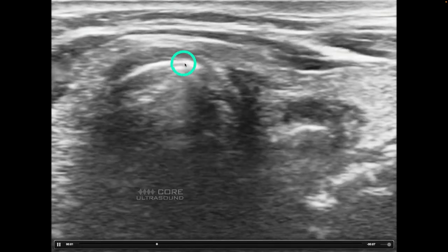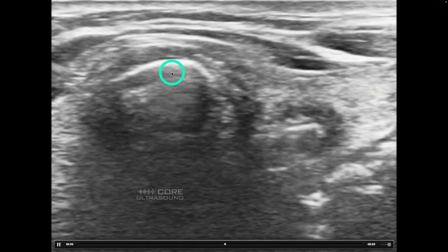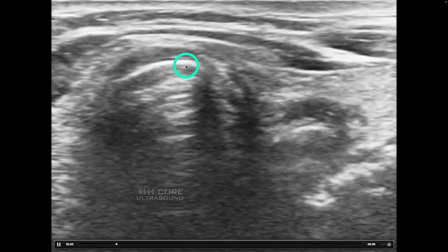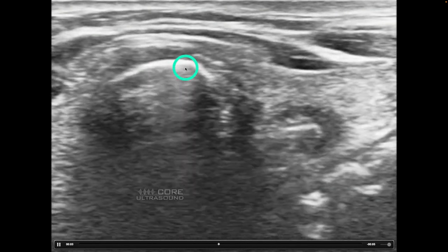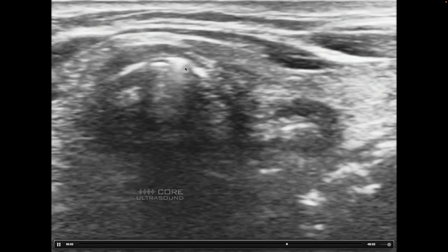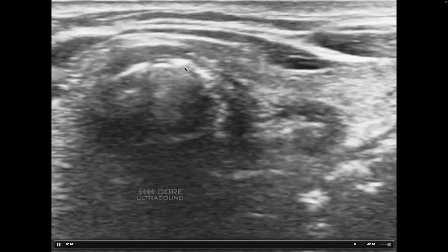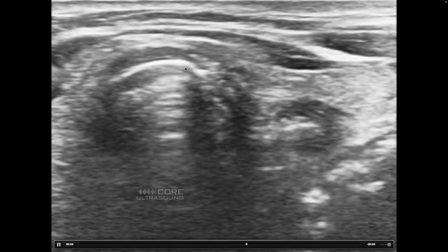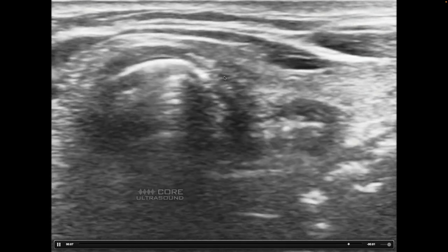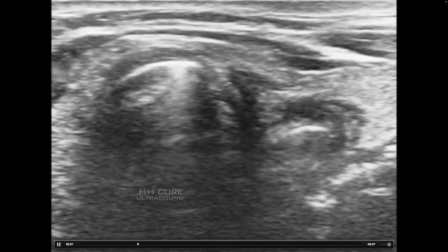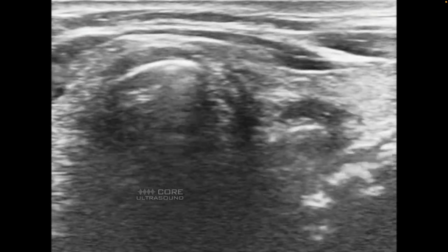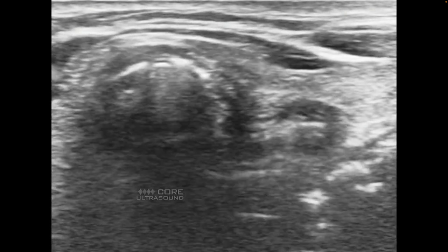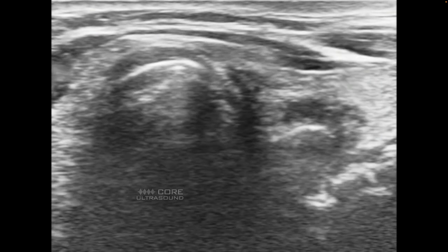Now what we can do is actually use the bougie to identify placement even before we do the intubation. You see how we have here some little almost like tickling of the more superficial part of that trachea - that is the gum elastic bougie with the little end pointed up, and I'm pushing it up and down the trachea. I'm feeling those tracheal rings, but it's nice to have this extra confirmation of that bougie actually being in the trachea and not in the esophagus where we don't want it. And then after we confirm that, we just slide that ET tube in and we are good to go.